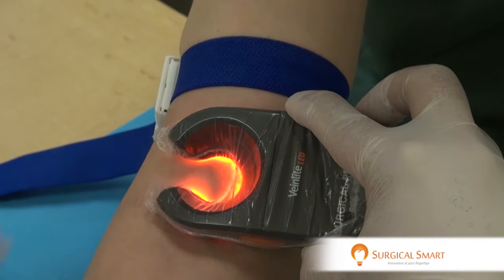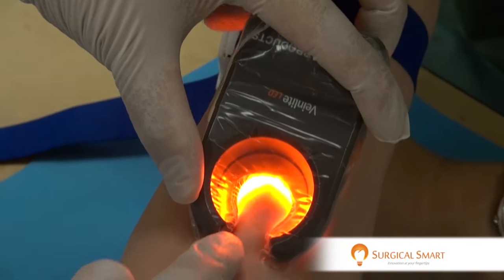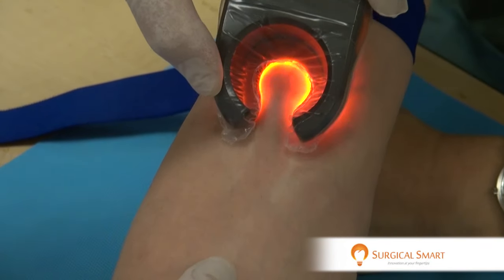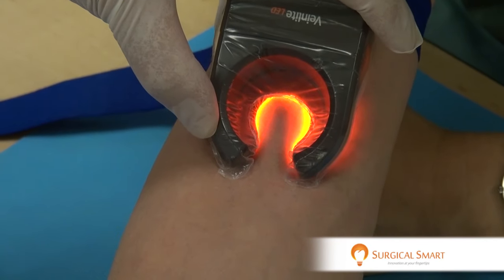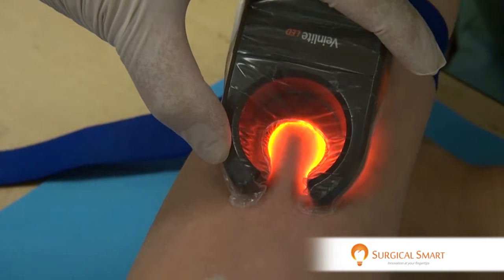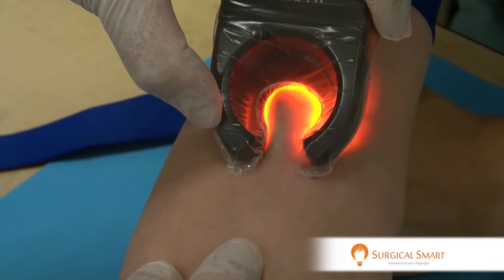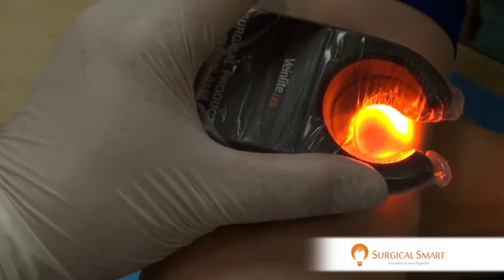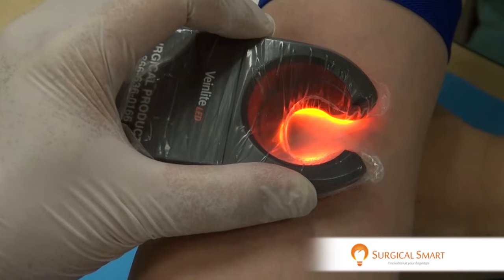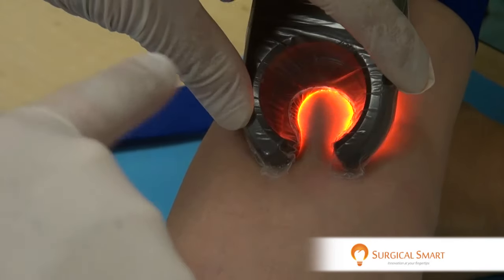See that? You can actually see where the vein tracks. Once you see the vein — which is that dark line — you can track the vein up and down the arm. You can see the vein very clearly; it's practically impossible to miss. You can move the VeinLight sideways and realize there's no vein on that side, but you can find the vein by just locating it. You can move it laterally, then turn it 90 degrees — now it's applying traction.